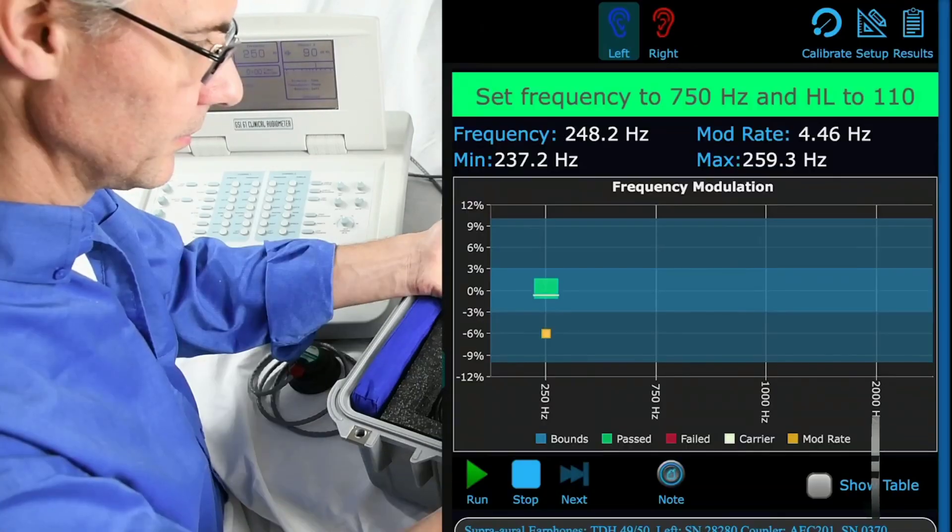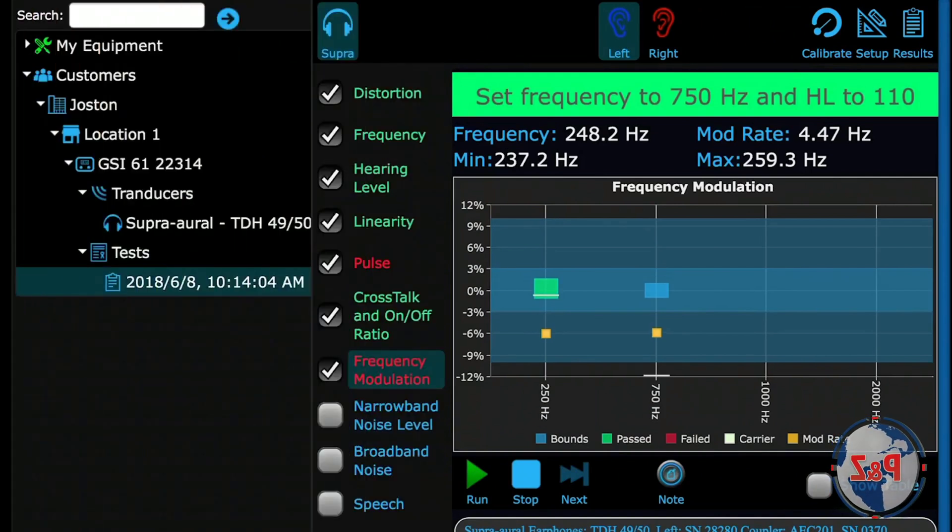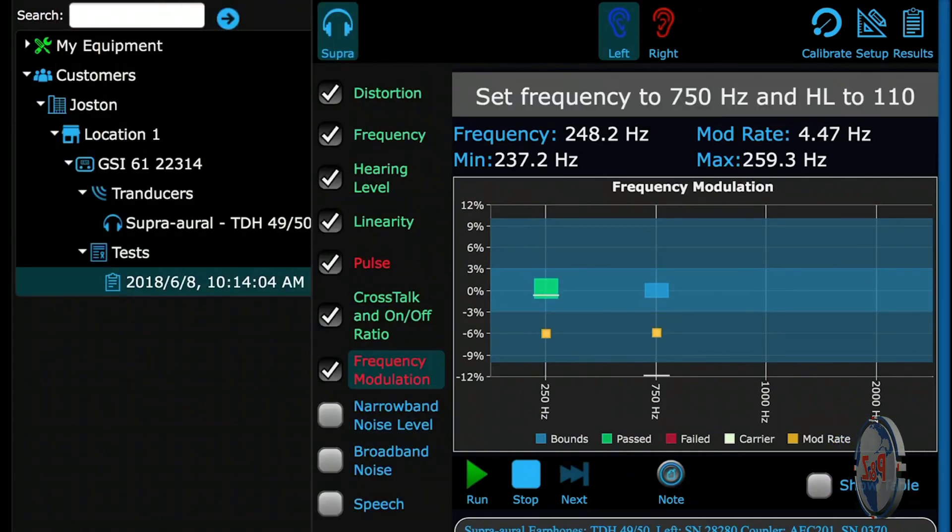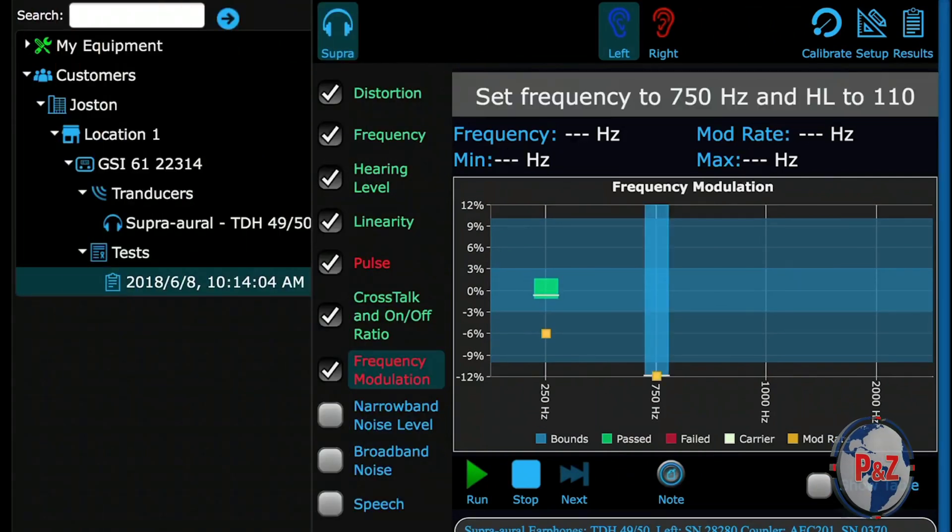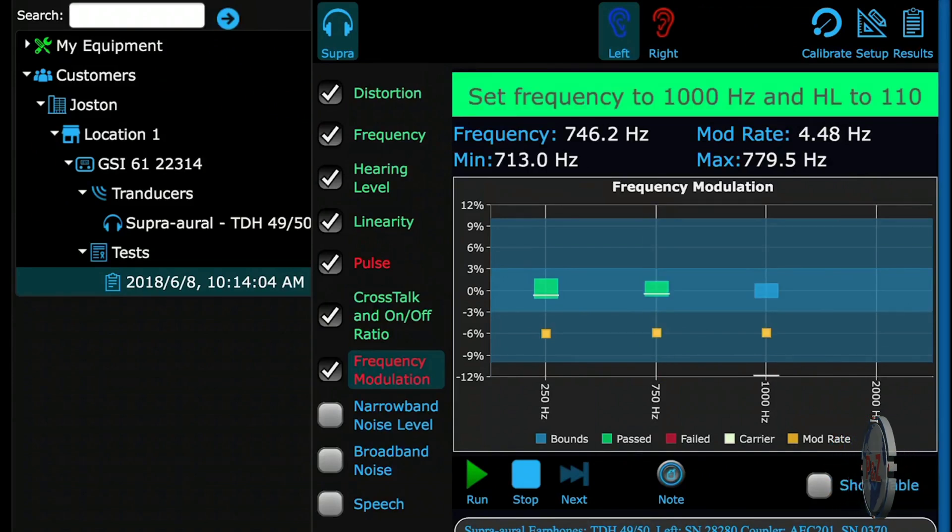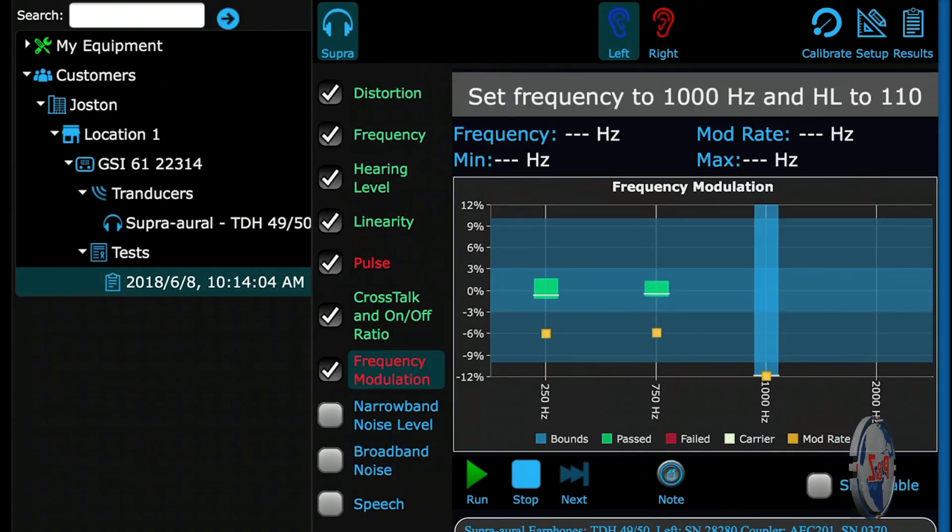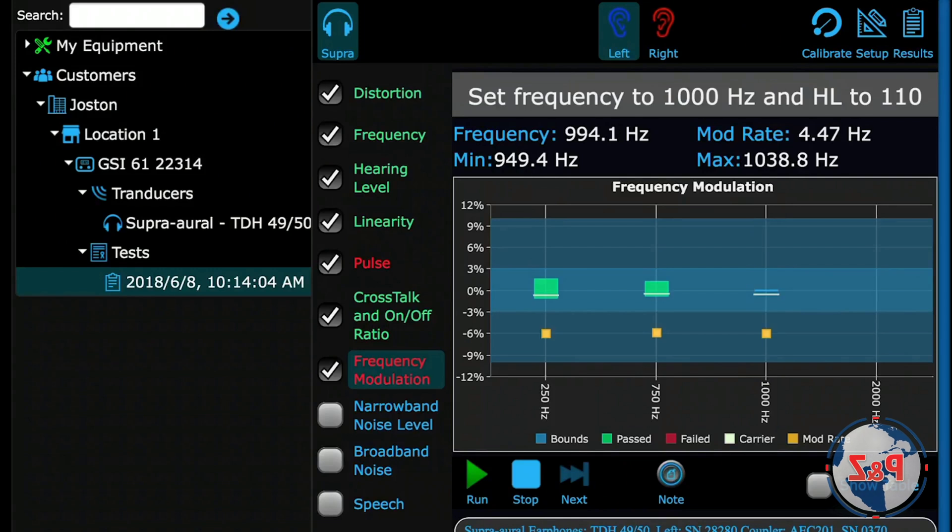Lastly, there is frequency modulation. The detected signal will need to be within the cerulean portion of the graph to pass. More information on this test, refer to the manual, but more importantly, the standard that you are testing to.